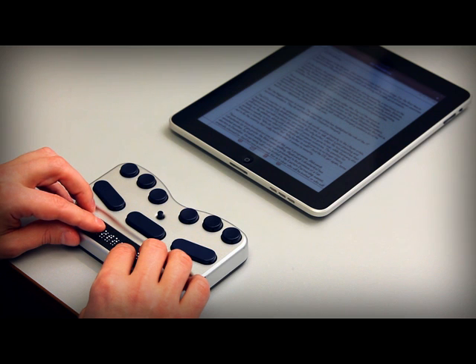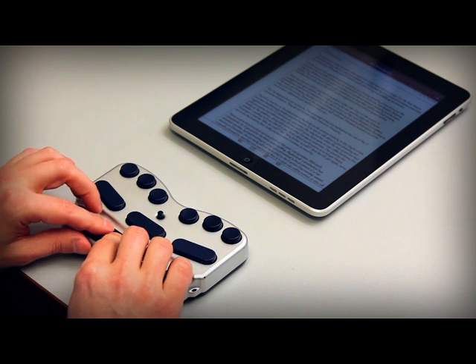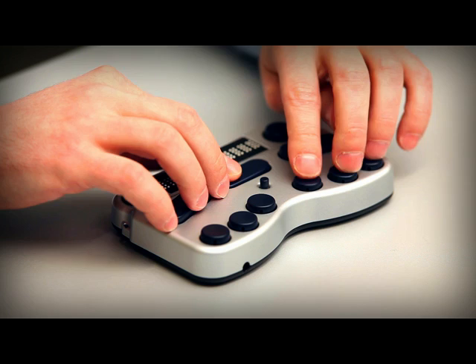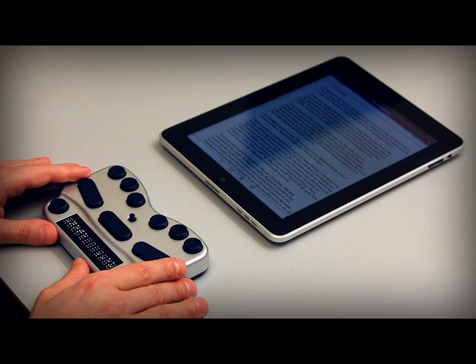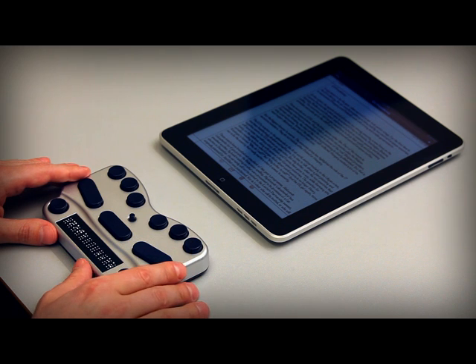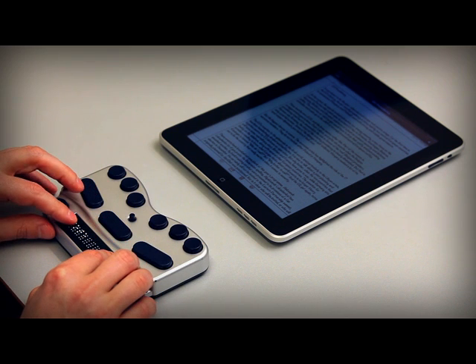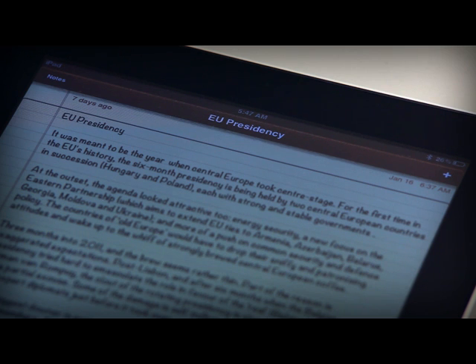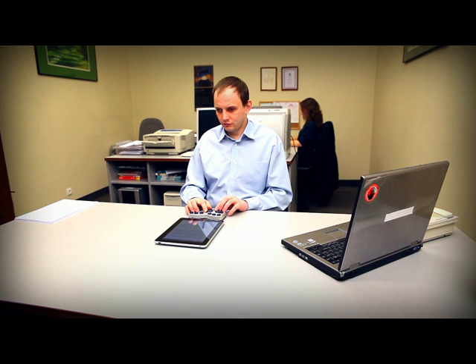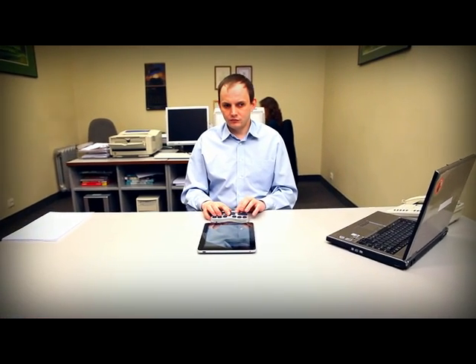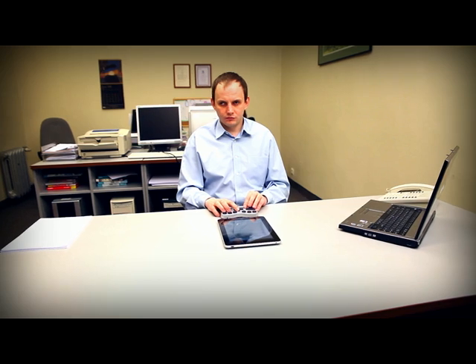To stop reading, press space plus dots 1234. The same key combination will resume reading from where VoiceOver stopped. To read only the area of the screen on which you're focused — in this case the body of the note — press space plus dots 1235. Reading begins from the cursor position in the focused area when it's a text field such as a note. This is different from reading the entire screen, which will also read the titles and buttons at the top and bottom of the screen.